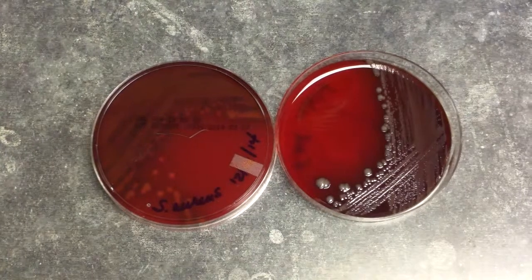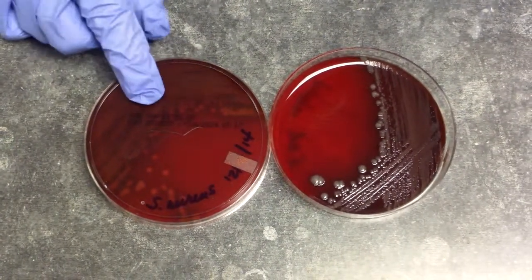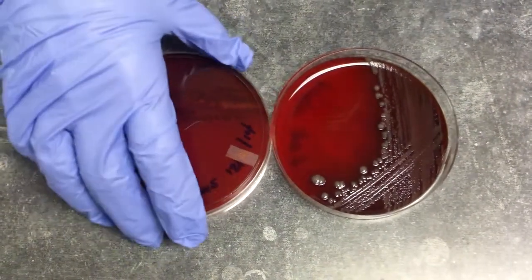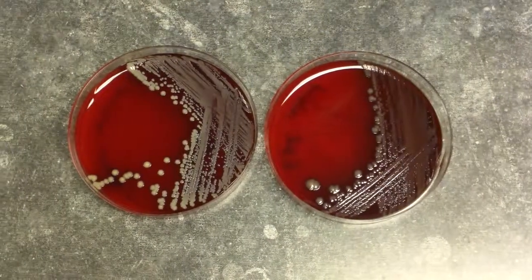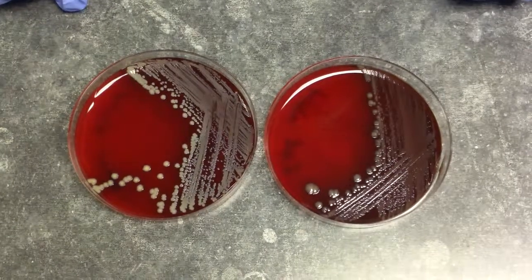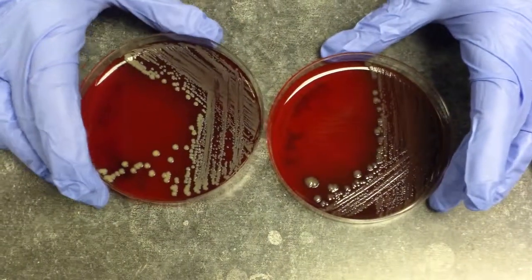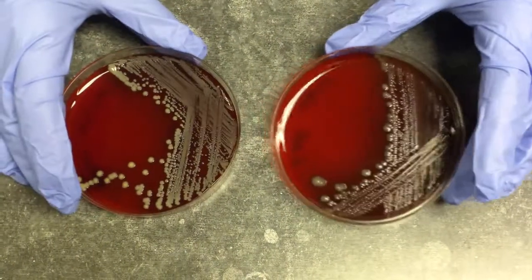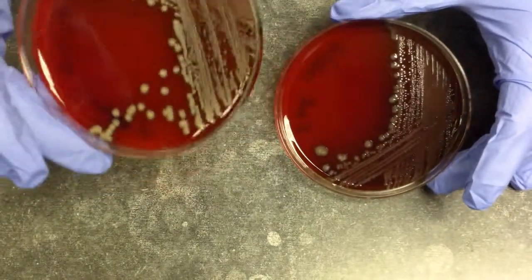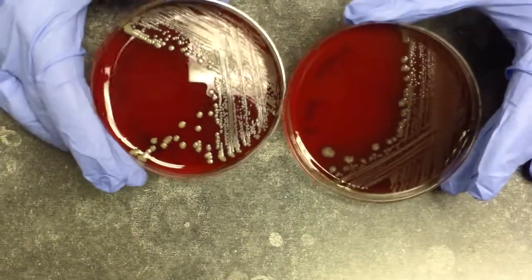The first media that we're going to deal with is the non-selective media, which is a TSA plate incorporated with sheep blood. The non-selective medias allow most non-fastidious organisms to grow. So we are able to recover most organisms, such as gram-positive organisms and gram-negative organisms. And you can see on these two plates we have a Staph aureus and an E. coli, and they both grow very well on the non-selective medium.